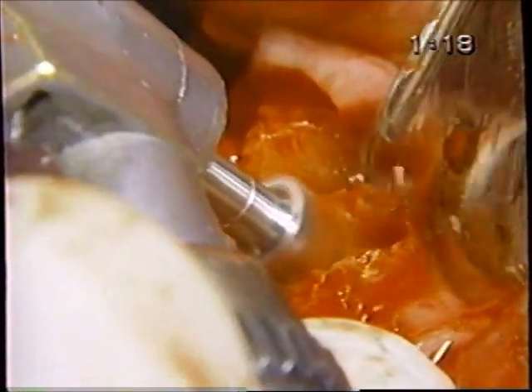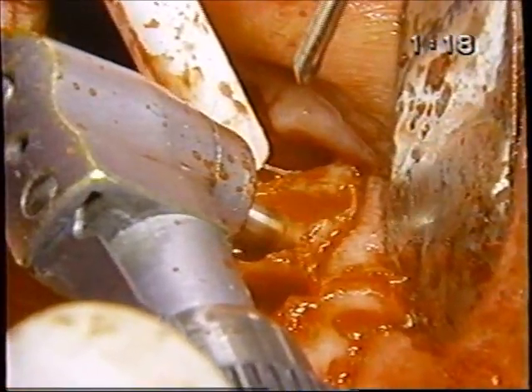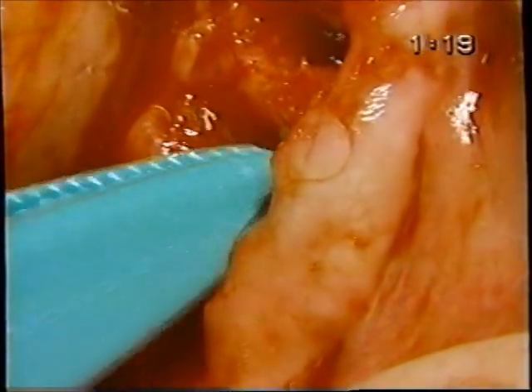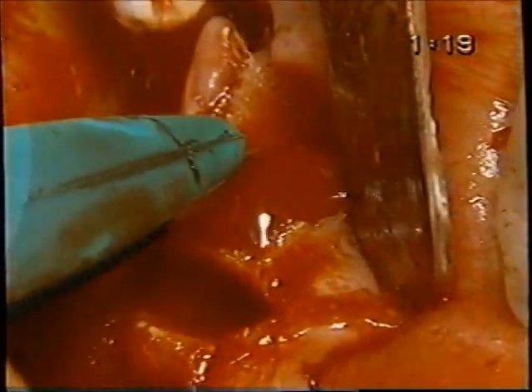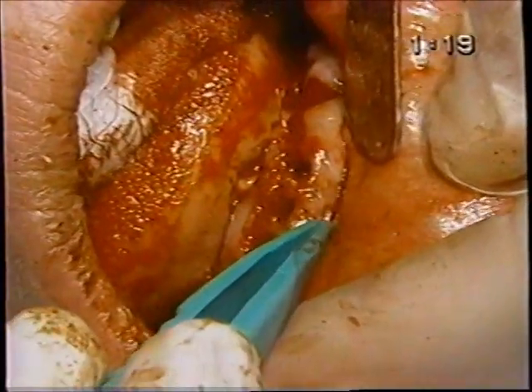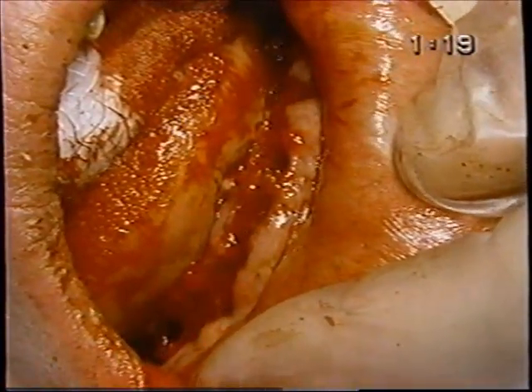Now, our patient is sleeping and is startled periodically. Where did the countersink line on the distal? Okay, I think we're there. Okay. These we use on occasion, particularly if we feel the patient won't have conventional titanium implants in the future, but we need to do something to help maintain the ridge. Now those are countersunk 2 millimeters below the crestal bone surface, and then we will close that with primary closure.